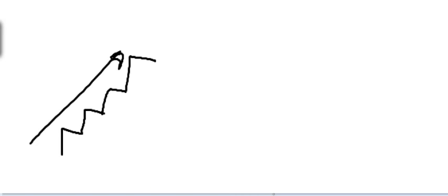If you have a thick slice, let's say a 1 centimeter slice, the computer will rearrange it in the following way: the first slice, second slice, third slice, fourth slice, each 1 centimeter thick. The image will look like steps, a stair, a ladder. Now imagine the original bone is like this. If you take it in 1 centimeter cuts, it will be like this. If you make it 1 millimeter cuts, it will be very close to the original one.